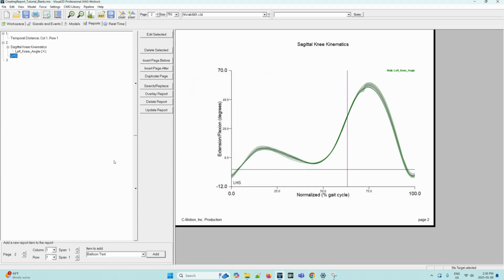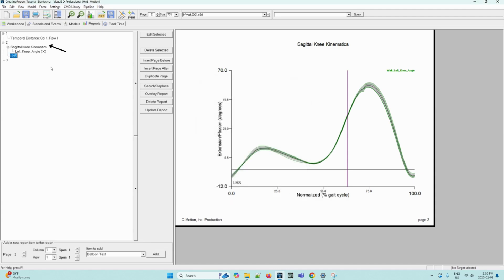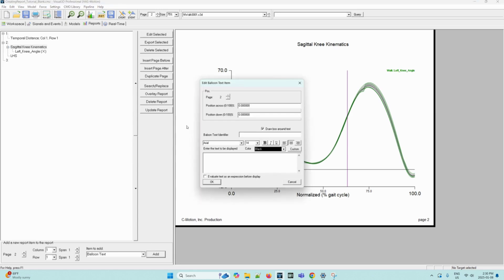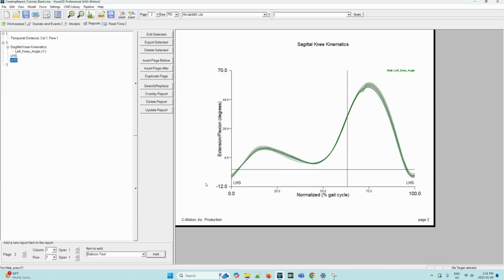We can also create a second balloon text image by following the following steps. So again, select add and then make sure that the page is selected rather than the balloon text that we've just added. And again, we can select add and then we can fill in the following information. So this time, the position across will be 89 and the position down will be 77. And again, we can uncheck the draw box around text. The identifier will be LHS 2 in this case. And the text to be displayed will be LHS. Now we can press OK.